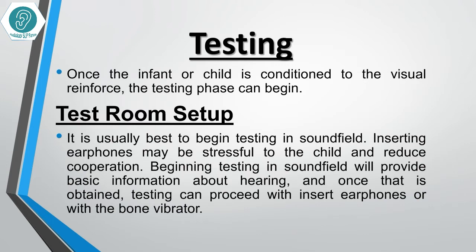Testing: Once the infant or child is conditioned to the visual reinforcer, the testing phase can begin. For test room setup, it is usually best to begin testing in sound field, as inserting earphones may be stressful to the child and reduce cooperation.